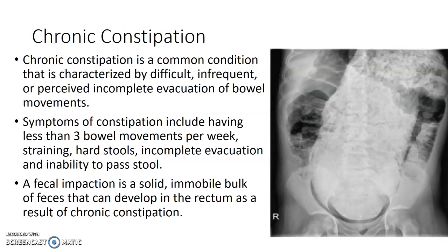All right. Chronic constipation. It's a common condition and the patients have difficult, infrequent, or incomplete evacuation of the bowel. This happens a lot and it can even give them a fecal impaction. So this is massive, massive fecal impaction. The water-soluble contrast tends to help with that and helps them clean it out and get rid of some of that. So it's not exactly diagnostic, but it's more therapeutic. So that may happen as well.